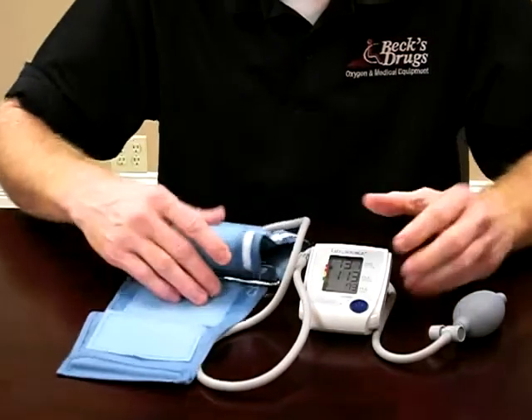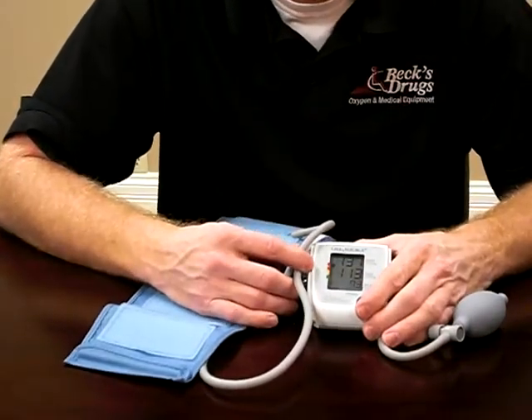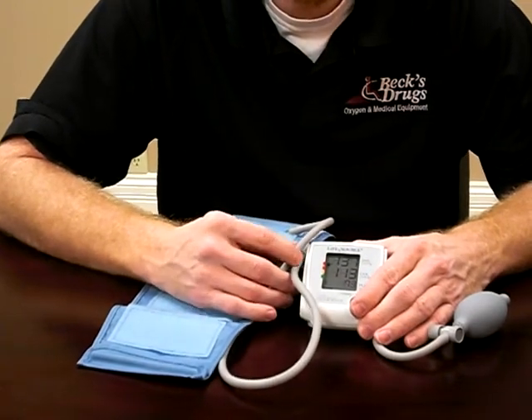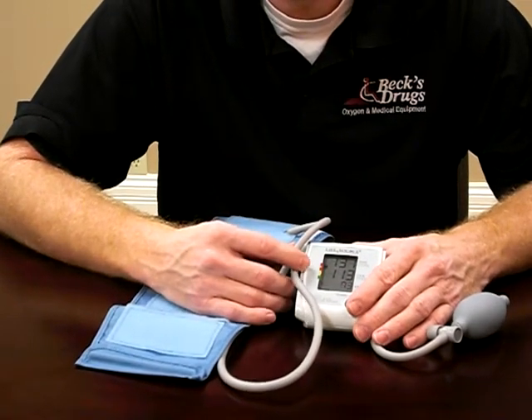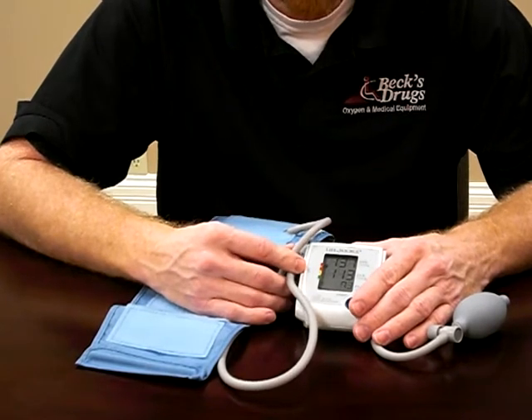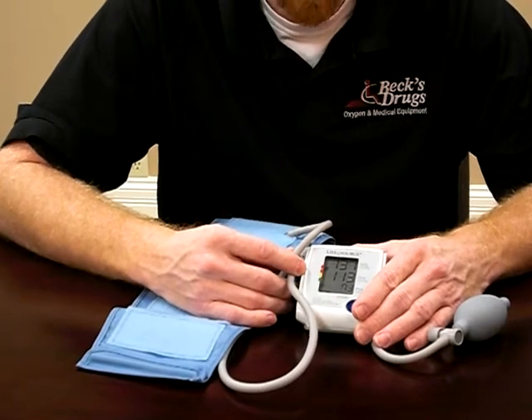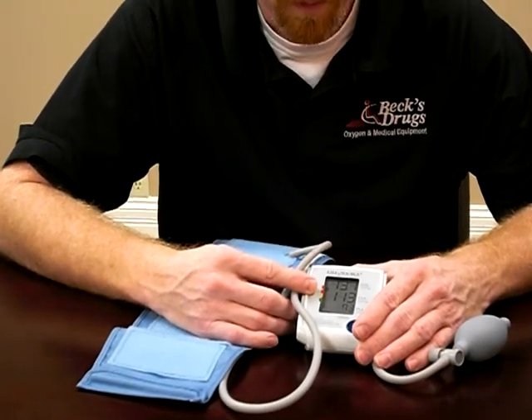On any digital unit, you need to make sure that you get a fairly accurate reading. If you get an odd reading, you can throw it out. They normally say to take an average of about three or four readings. If you have a real high or low reading that doesn't match the other readings, you can throw it out or take an average of your good three readings.